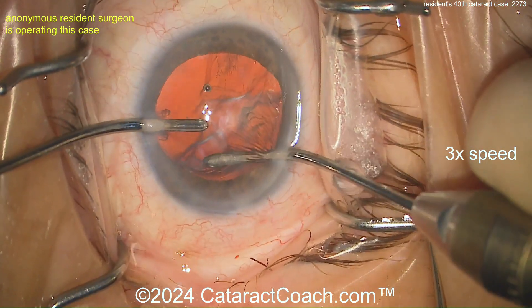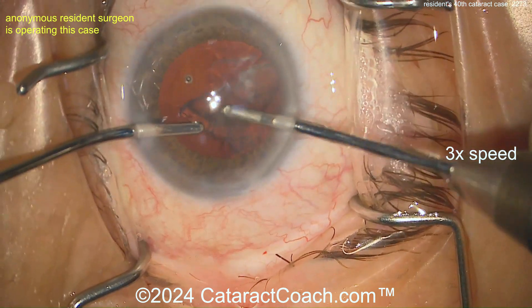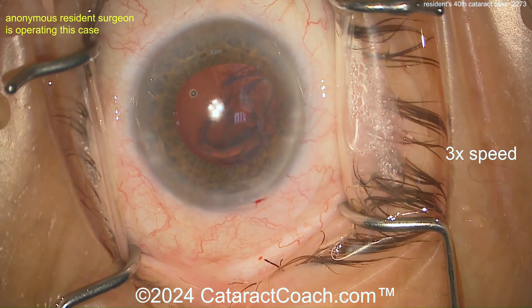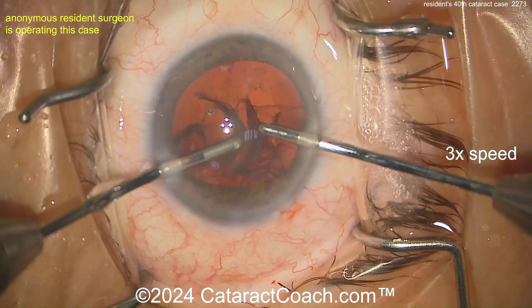Bimanual irrigation and aspiration is very helpful — gives you good access. Cleaning that up nicely. Getting that sub-incisional piece — then switch hands. There you go, I predicted it. Watching the video for the first time with you now. Cleaning up the rest — it comes out pretty nicely.